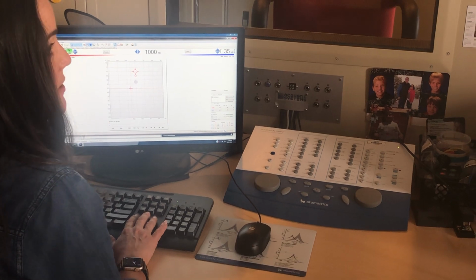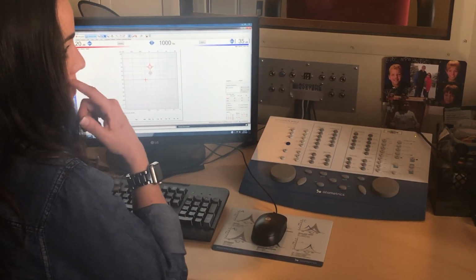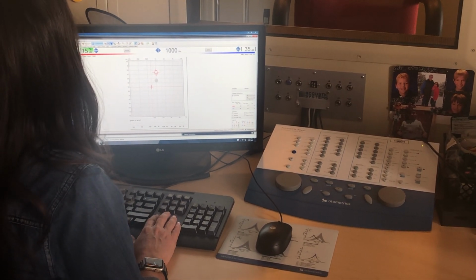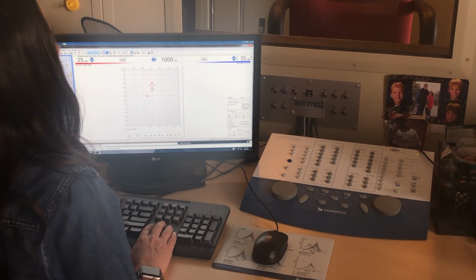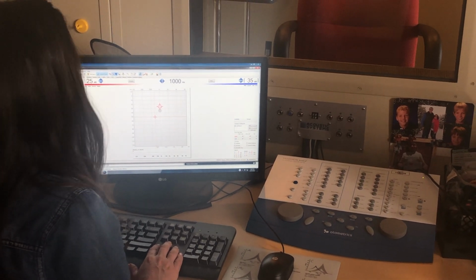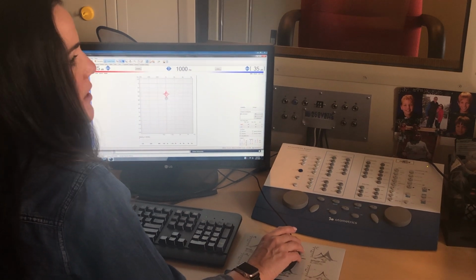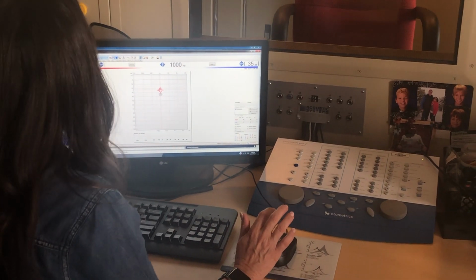Now I'm going to do it again. 3 times, it's done. Okay, now what if they didn't? What if they gave it to me there first, went there, oh, no response, so I got to go up. I got it there this time. I can move it just by pushing store again. Okay, so it's not permanent, and you can even right click to delete that if you store the wrong symbol.